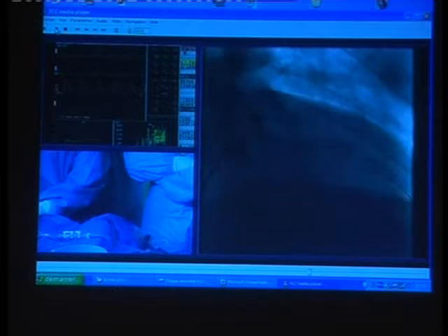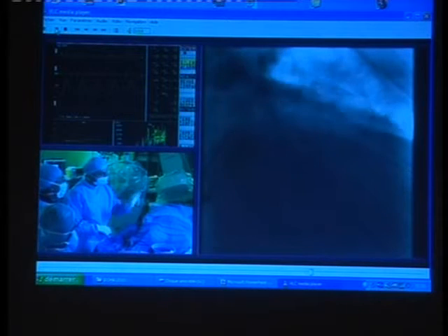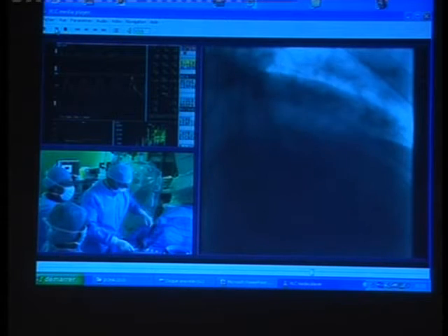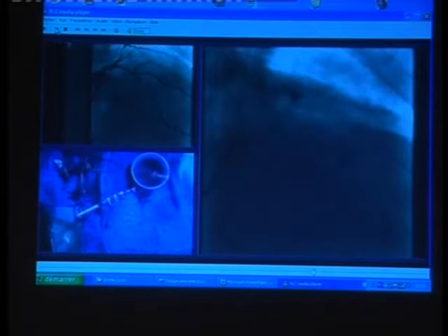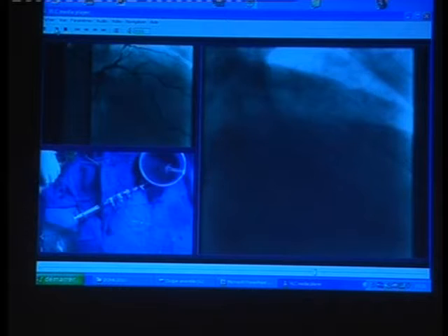The stent is deployed. In this case, the pressure inflation was moderate, 14 atmospheres. What I will do now is a small puff to see what happens, and maybe do an additional balloon inflation inside the stent. Because it's a long stent, we need to carefully deploy the stent, and maybe it requires more balloon post-dilatation.